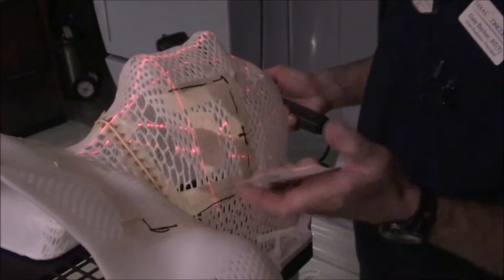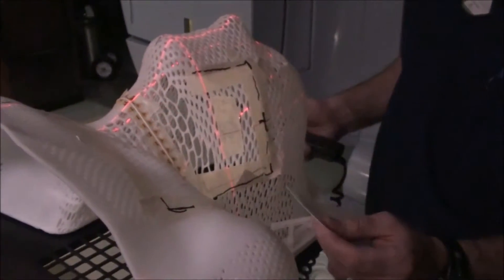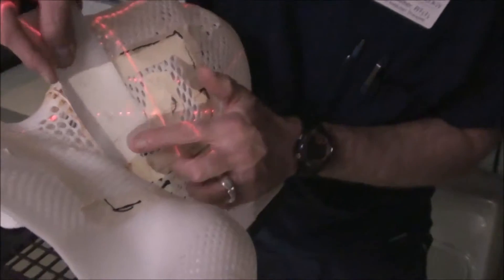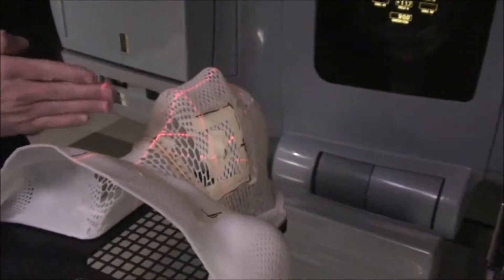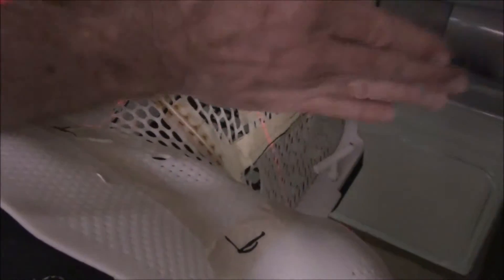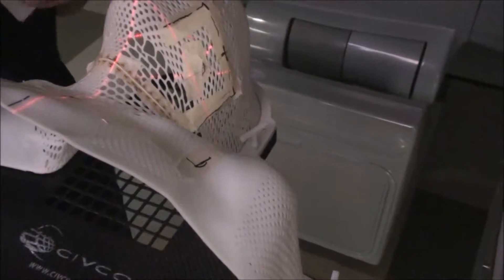We're shooting for the same field size essentially, but our CR is going to be in a different location. We're going to walk it in manually until I have it where I want it. You can see that we've got the inferior edge of our field in line with our wire, and we've got our field size set about where we like it. We're going to end up with our CR right there. We've got an issue already: our inferior divergence is such that the inferior edge of this field size is coming in at an angle. Since it's coming in at this angle, we're going to diverge into our supraclavicular. On the contralateral side we're going to have a hot spot; on the lateral side closest to us, we're going to potentially have a cold spot between the supraclavicular and this juncture.